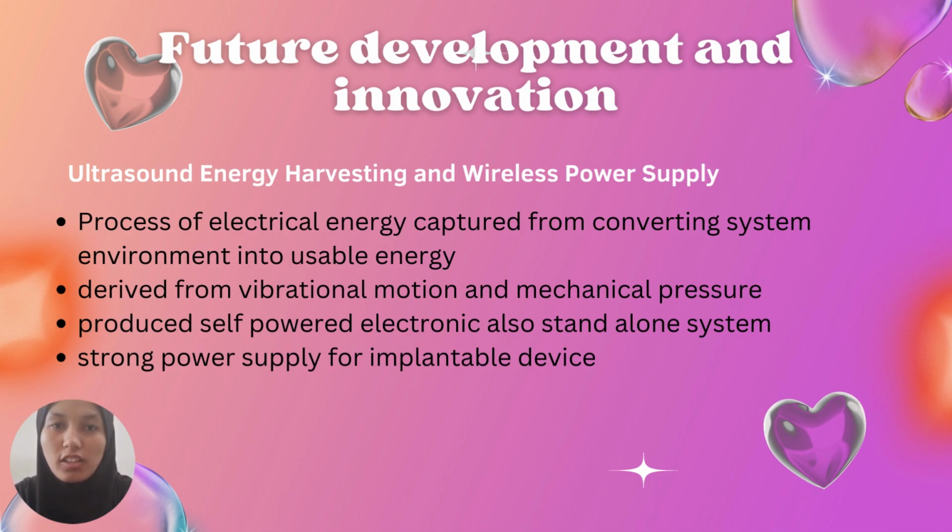Diagnostic ultrasound could make some innovation to enhance power saving through energy harvesting. Energy harvesting, or power harvesting, is a process of capturing electrical energy from the system's environment, such as kinetic energy and thermal gradient, and converting it to usable electrical energy.